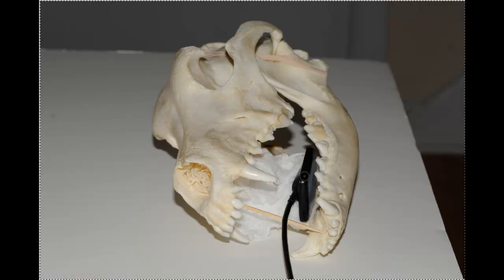As we move the sensor forward, however, we start to get a divergence between the angle of the sensor and the angle of the teeth. So now we have the sensor approximately like this, whereas the teeth are about like that. So our angle halfway between would be roughly like that.